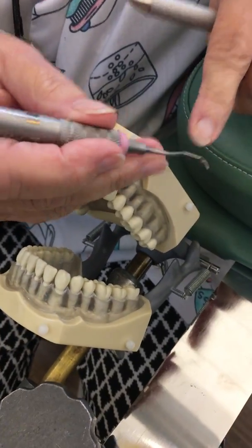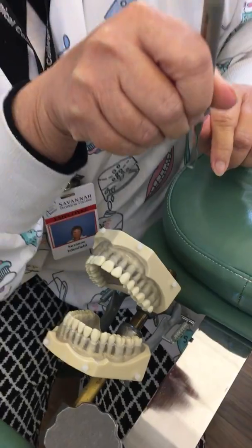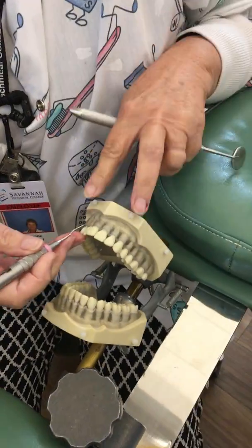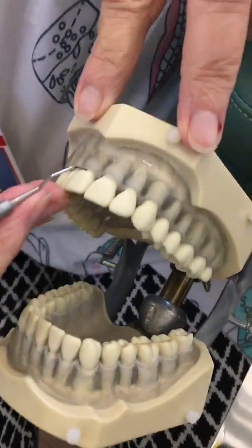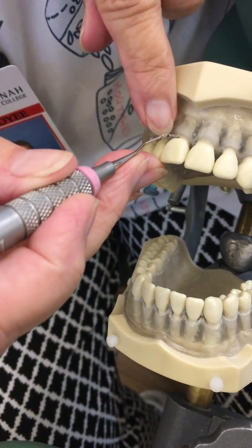We have to determine the correct end, and we cannot use the lower third of the shank because they're both straight. I'm going to go in the away direction and check for the correct end — I don't want to see the face. Do you see the face?